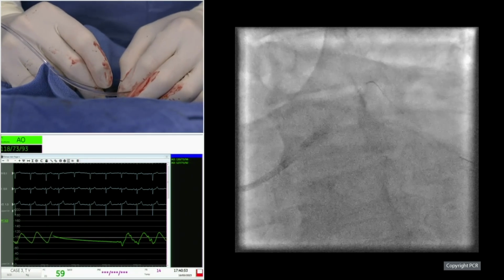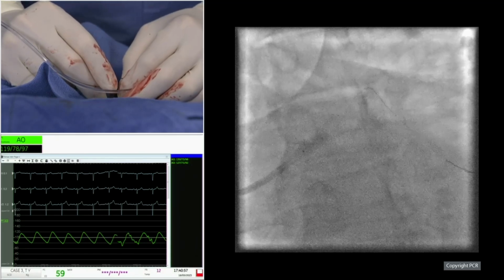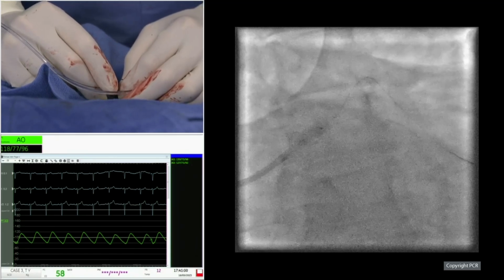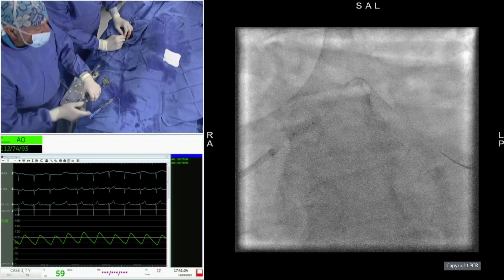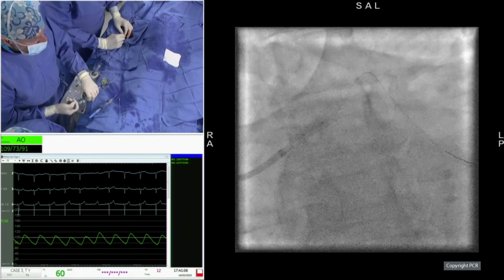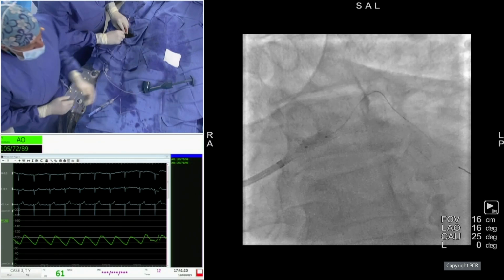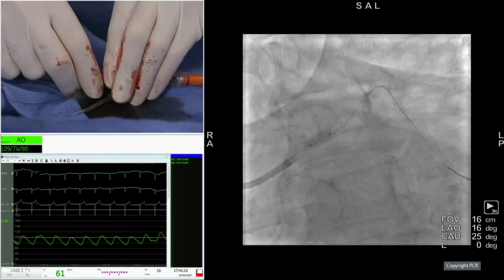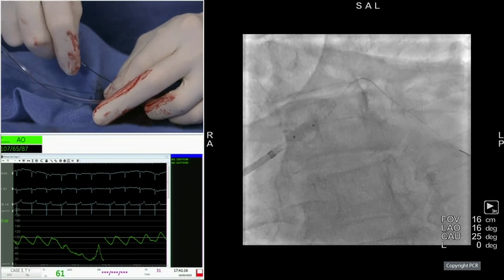It's our standard of practice to do sequential and then final, and what is important also is to deflate simultaneously the two balloons. As you can see here, we use a 4.5 shorter NC balloon, 8 mm, in order not to go up to the carina where we have done the kissing. It's just to reshape the proximal part of the stent.